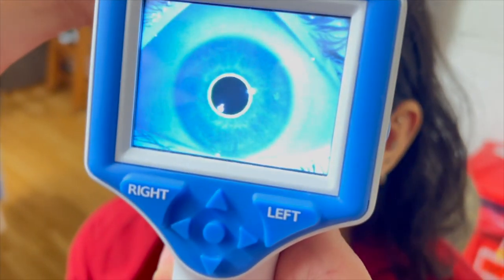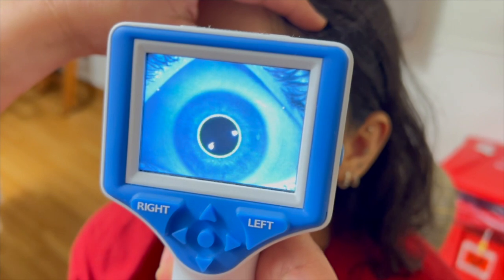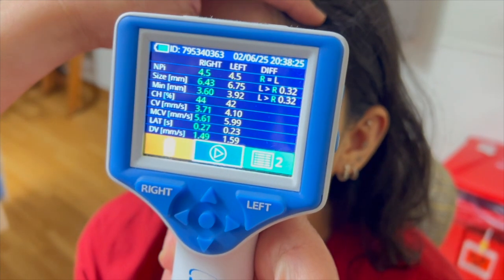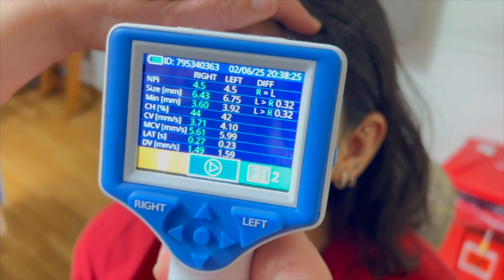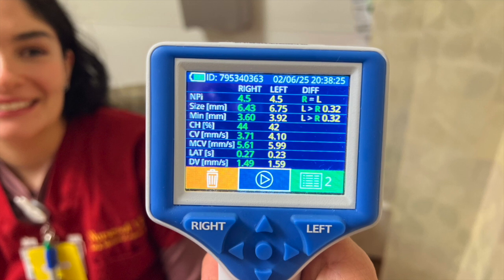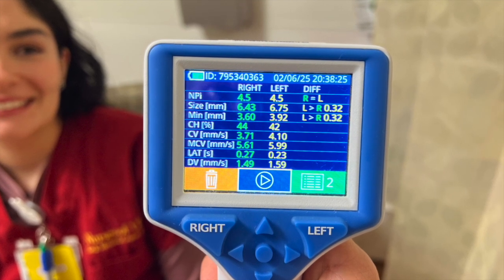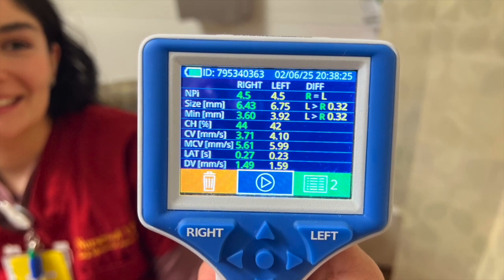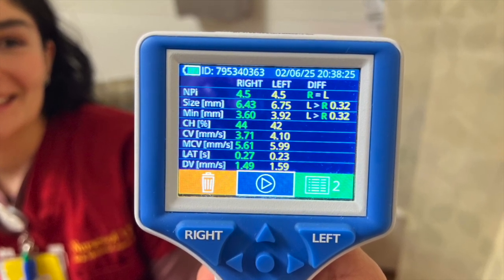Once the green frame appears, release the button holding the Pupilometer steady in place for approximately three seconds until the results screen is displayed. If a measurement error occurs, the results screen will show a red re-scan message — simply repeat the measurement for this eye.